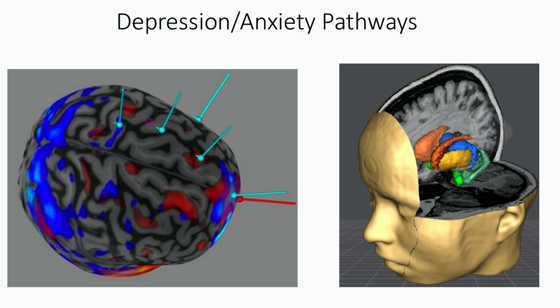So since joining the faculty at Penn, we've been trying to stimulate indirectly, again, some of the deep subcortical regions that we think are particularly important for anxiety and depression, like subgenual cingulate and the amygdala. But just because we're aiming to engage those circuits doesn't mean that we did, especially at the individual subject level. So we do these resting correlations, we look for hotspots correlated at the cortical surface, and we just start pinging them to say, hey, does it look like they're actually engaging the intended targets?